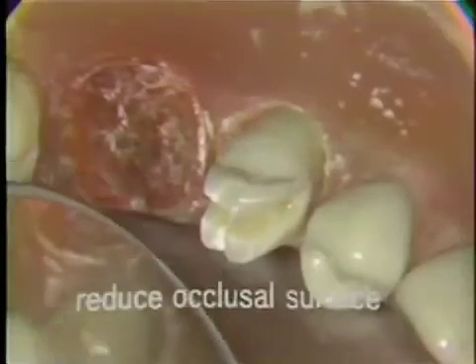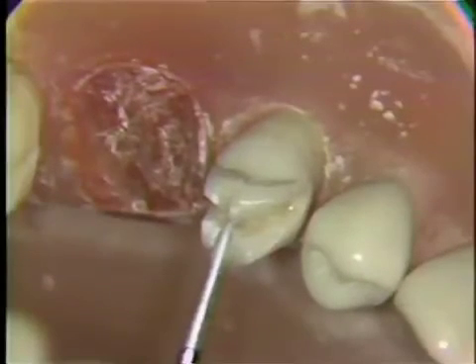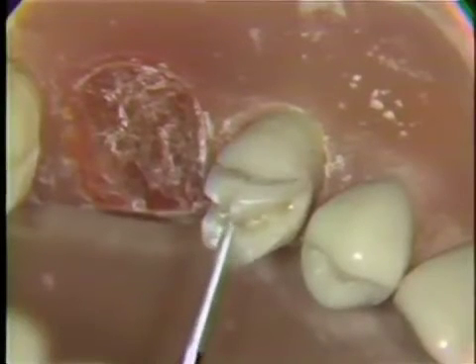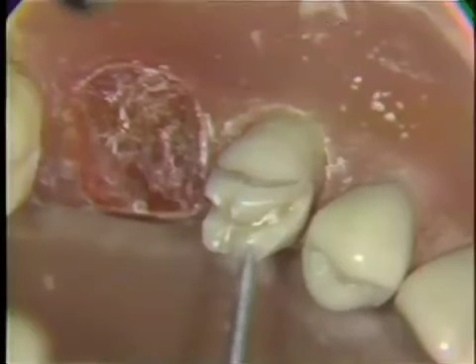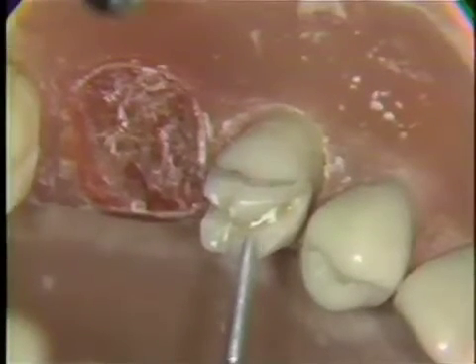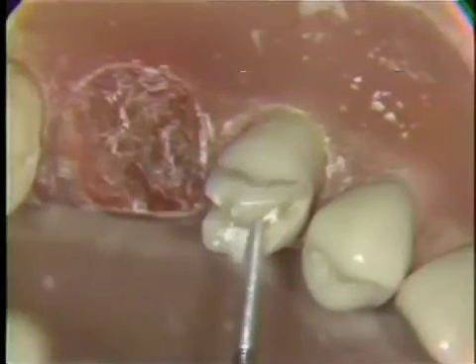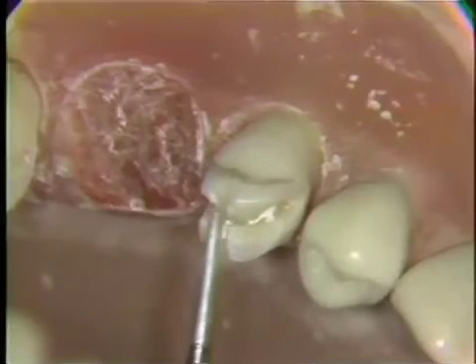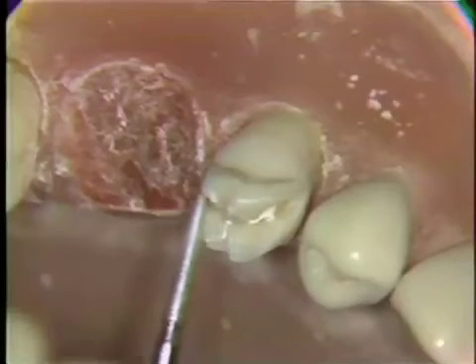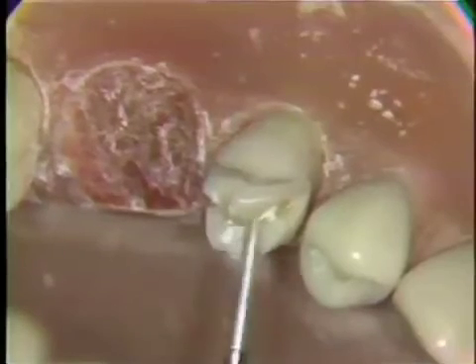The occlusal surface is then reduced utilizing occlusal tracer cuts, which are made to the full diameter of the diamond instrument. Once the tracer cuts have been placed, the occlusal surface is reduced to the depth of the tracer cuts following the original occlusal outline. Note that the tip of this diamond is tapered, and the diamond will have to be buried a bit further in order to get adequate depth.